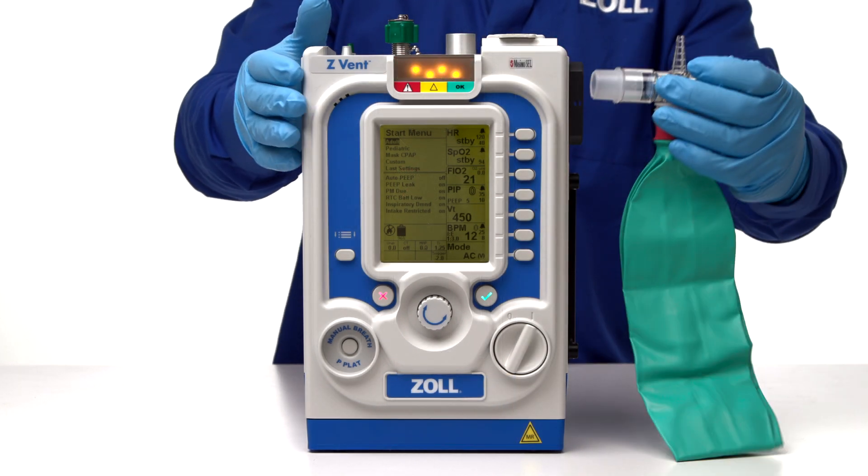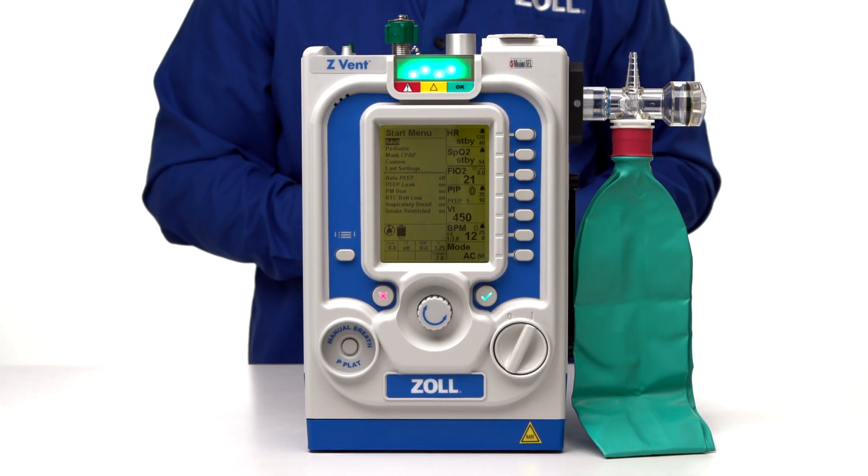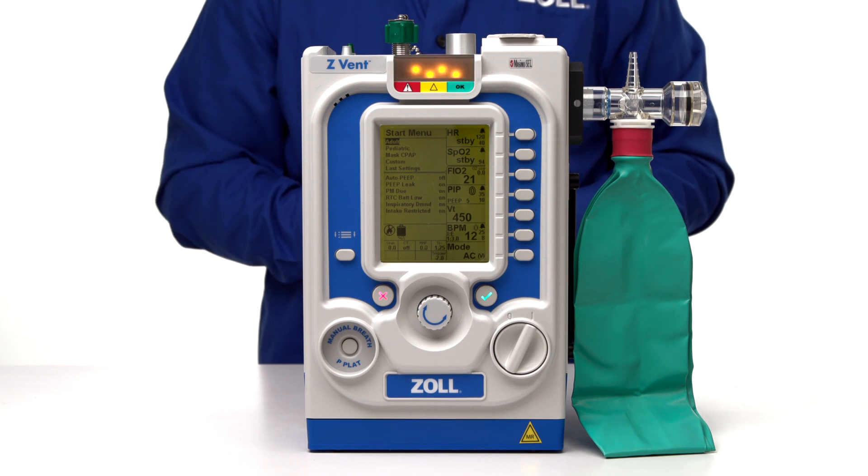Zoll offers an oxygen reservoir bag assembly kit that allows the use of low flow oxygen with the ventilator. This provides supplemental oxygen to the patient via a flow meter or oxygen concentrator. Oxygen is delivered through the fresh gas intake port when the internal compressor is used.